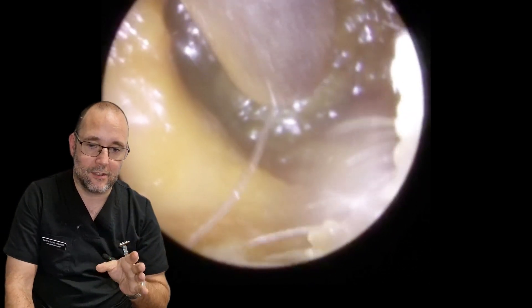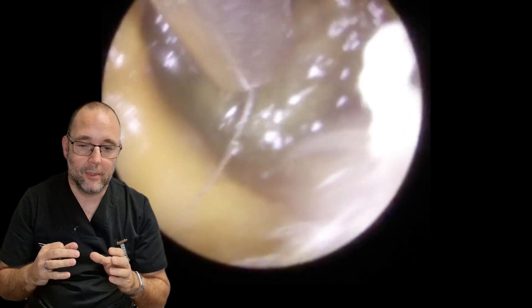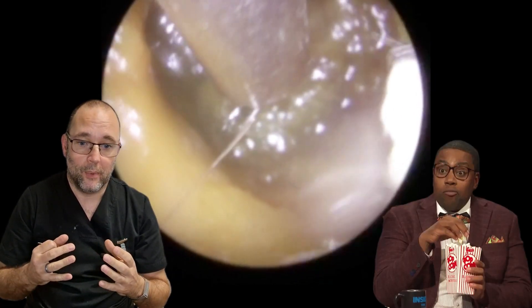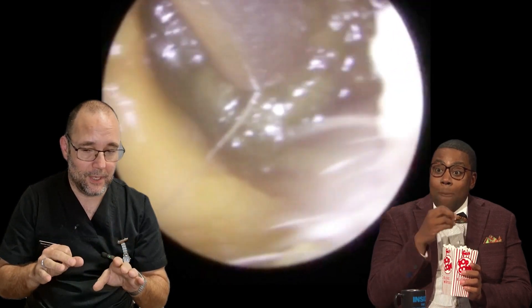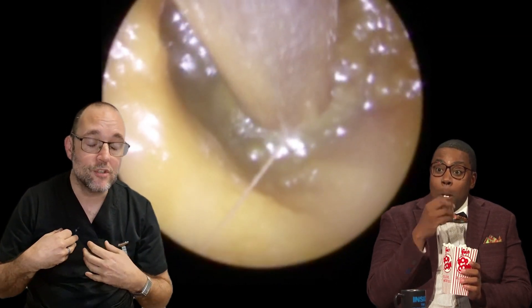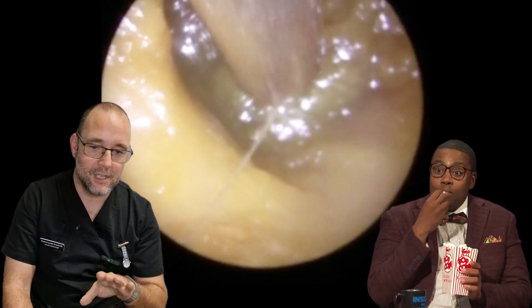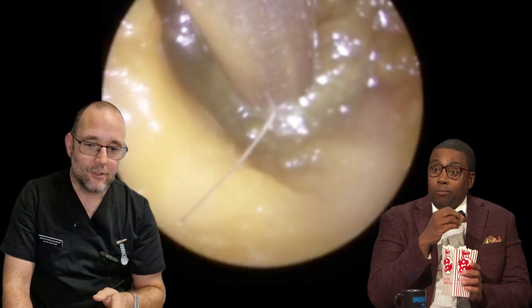I'm approaching this slowly because she's done a great job of softening it up, but sometimes the whole thing can jump up into the tube, so I'm being a bit cautious. Obviously when it jumps it can make me jump and can make the patient jump too, and we don't want that. So I'm approaching really slowly from the bottom.